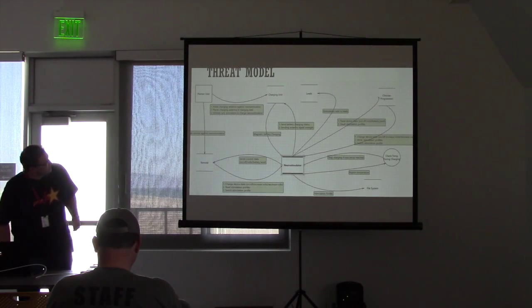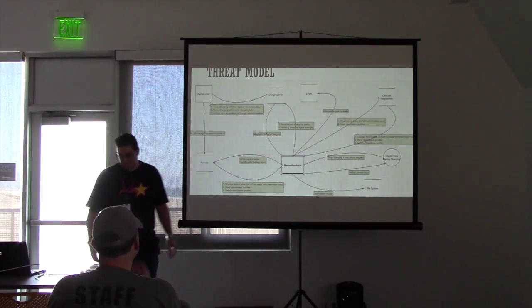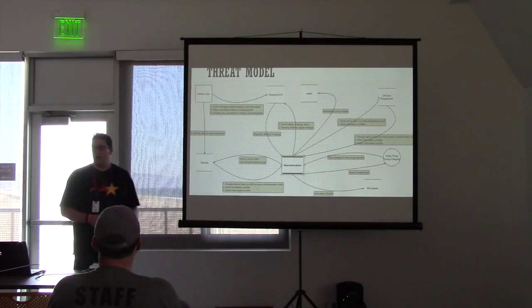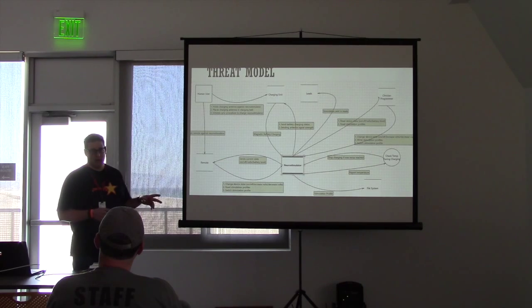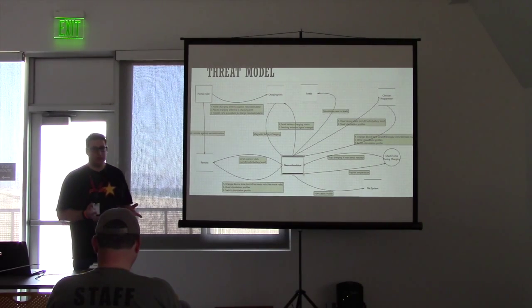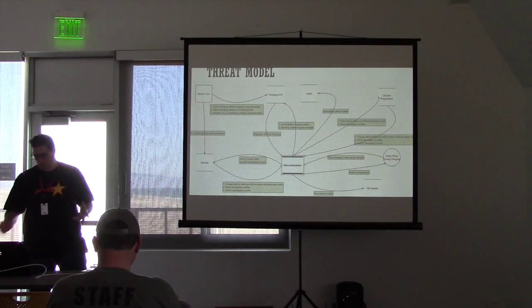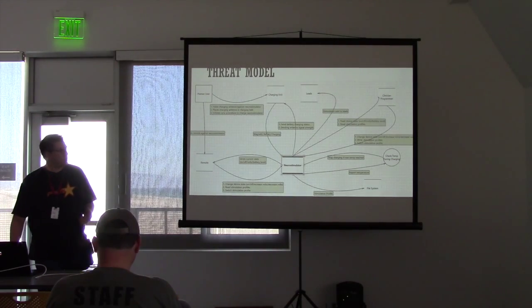So let's talk about the threat model. It looks like it's slightly cut off, but this is the threat model that I built. When I originally did it, I did it on a piece of notebook paper, and I threat modeled 2 or 3 different models from different companies. The company that she has a model for is called Medtronic. They make 20 different models alone. Between the 3 manufacturers, I think there are 40 or 50 different models of these stimulators, which have different features. Going through those and trying to figure out which one is the most secure for the situation was quite an interesting task.